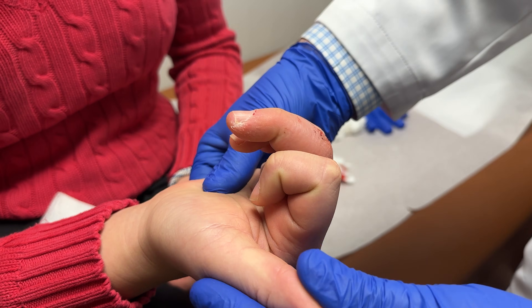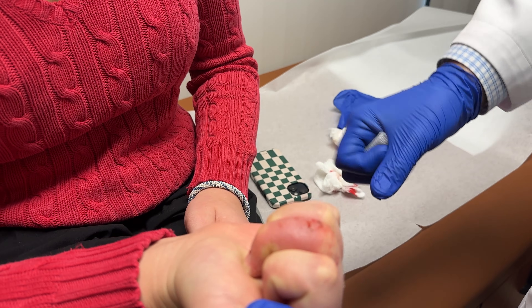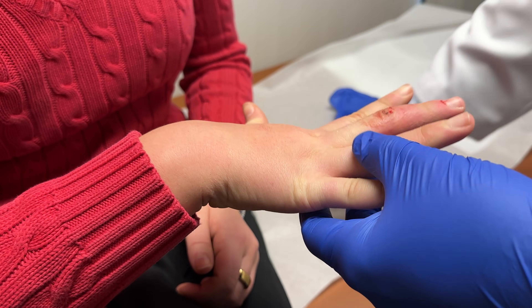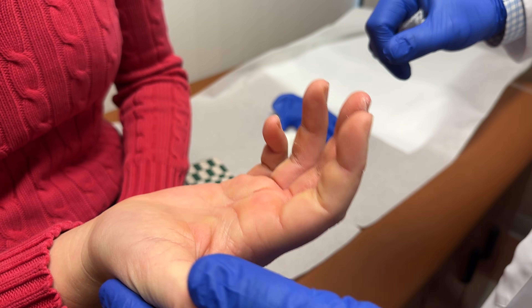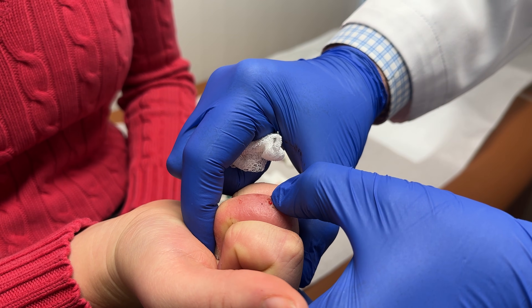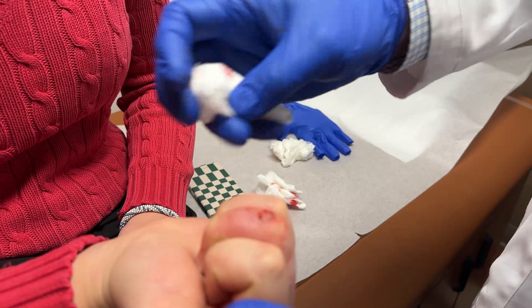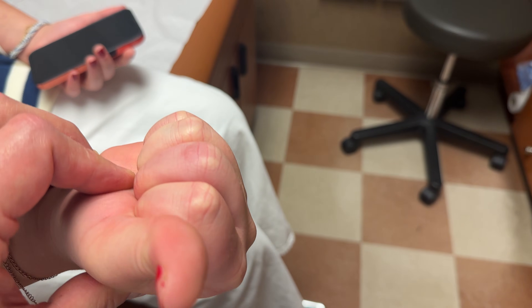I recommend waiting 10 to 15 minutes before manipulating the finger, as the pin sites can really sometimes bleed a lot. The patient is asked to fully flex and extend the finger — you can sometimes hear a pop, which is the adhesions breaking up. You can give a little bit of help in flexion while at the same time pushing down on the base of the middle phalanx to unload the fracture. If the DIP doesn't have full extension, you can fully flex the PIP and passively extend the DIP. The patient is placed in a dorsal extension block splint, or you can consider just buddy taping. She was sent for occupational therapy for full active and passive range of motion.